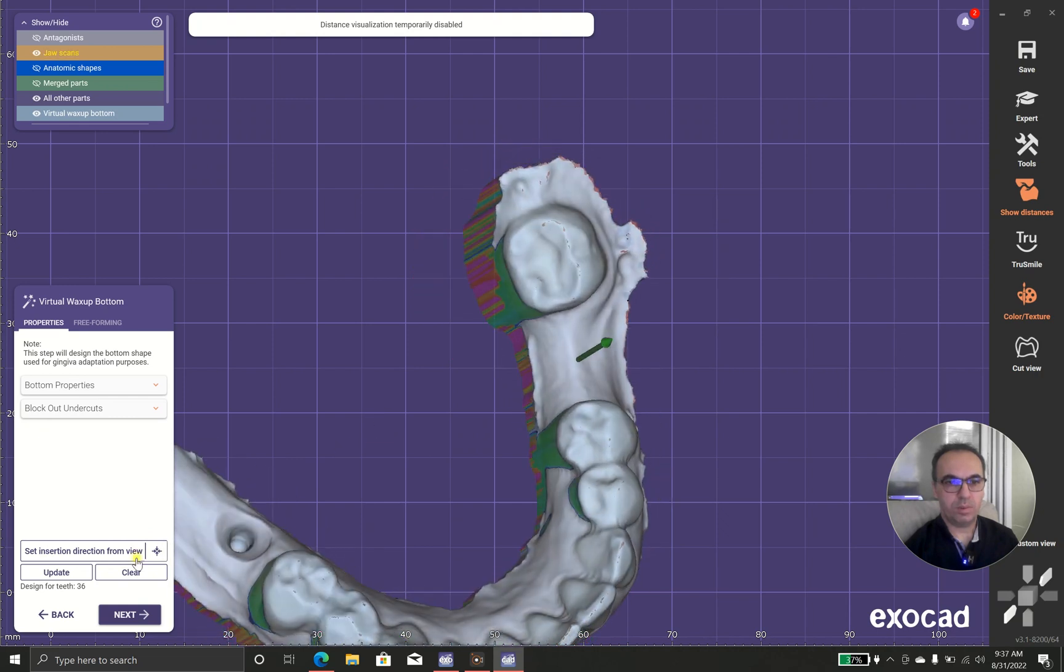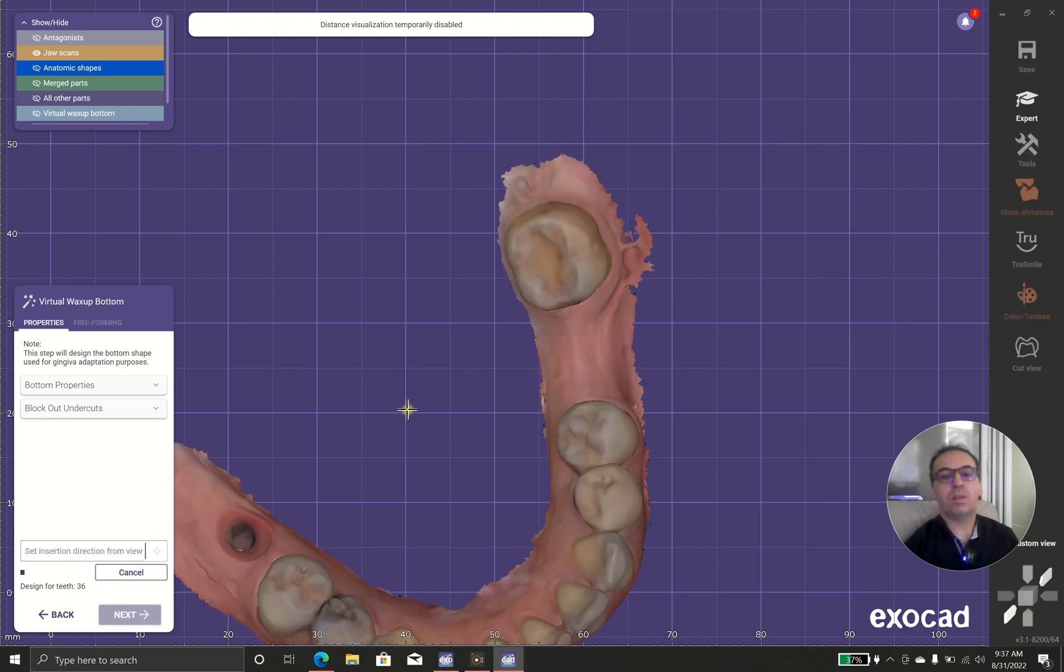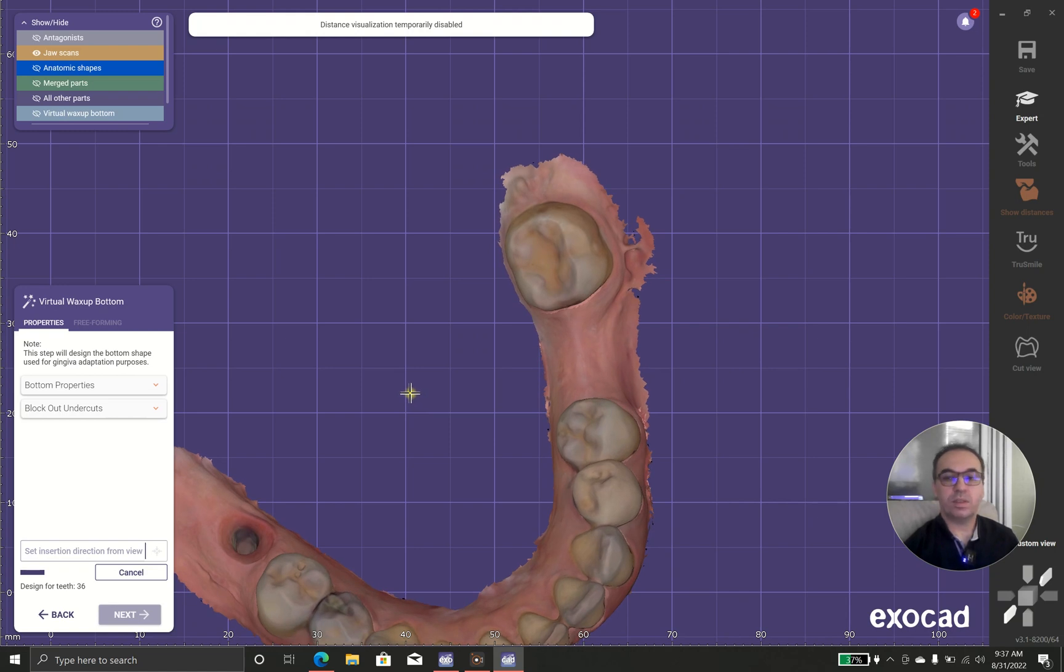Actually, I prefer this, the way you use the insertion direction directly.